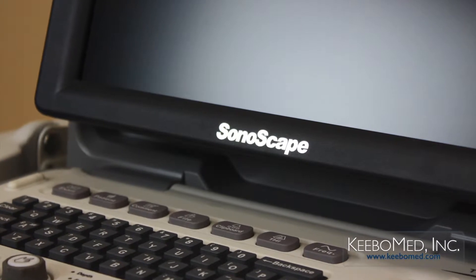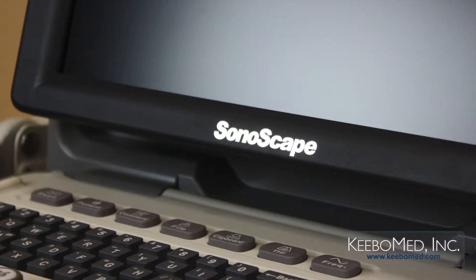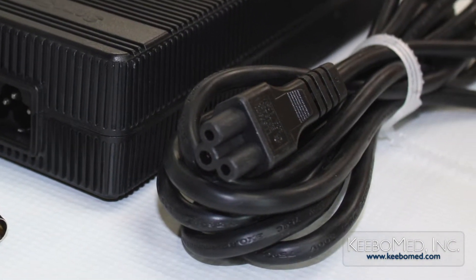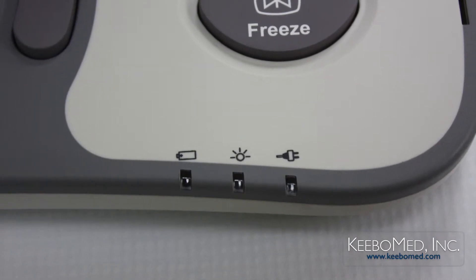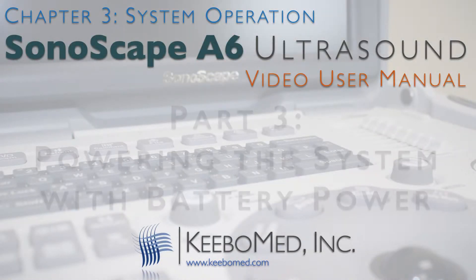The Sun Escape A6 can be powered by two different sources. In the previous video segment, we considered the proper procedure for powering the system using AC power. In this video segment, we will see the proper procedure for powering the system using battery power.